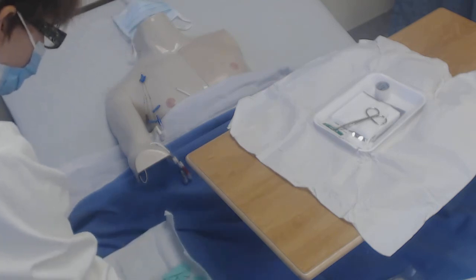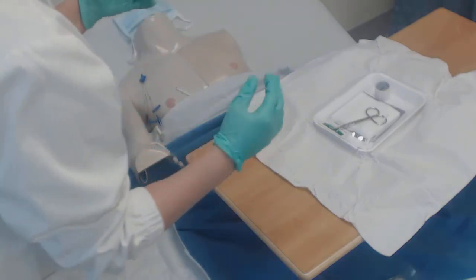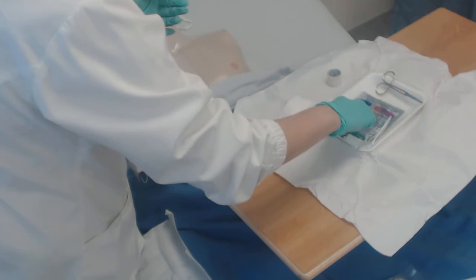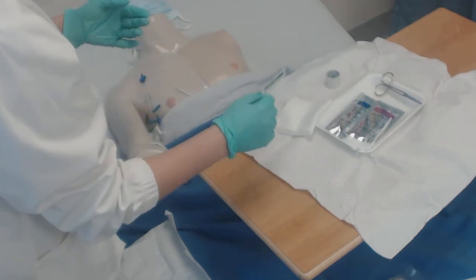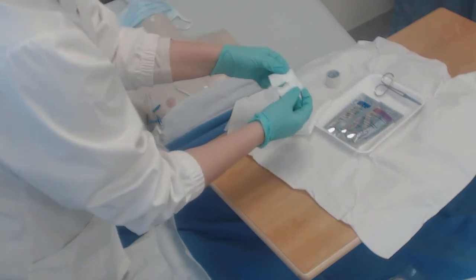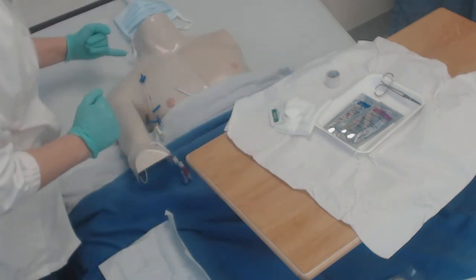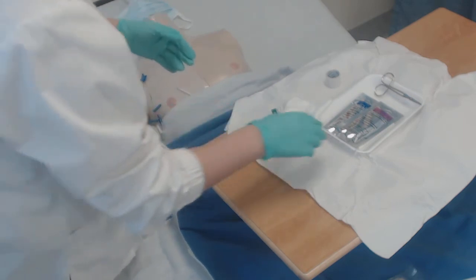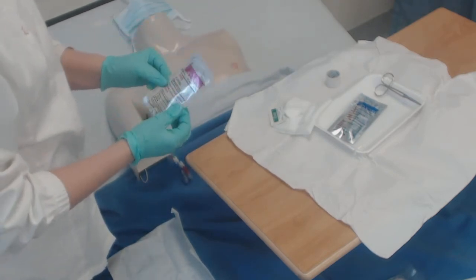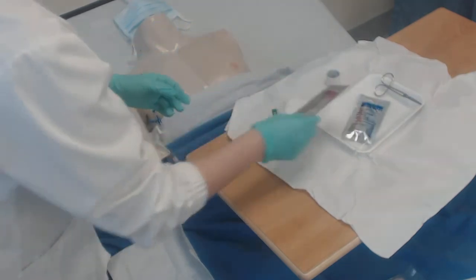If you were gathering supplies separately and didn't have this kit, you would need clean gloves, sterile gloves, possibly some tape, some four-by-fours, antibiotic ointment or Betadine ointment if that's what your hospital calls for, possibly a small split dressing. Not many places use split dressings because they like to see the insertion site and check for any drainage. You'll also need swab sticks — usually hospital-specific, either chlorhexidine or Betadine, the brown stuff.